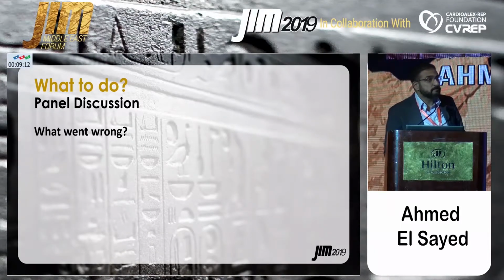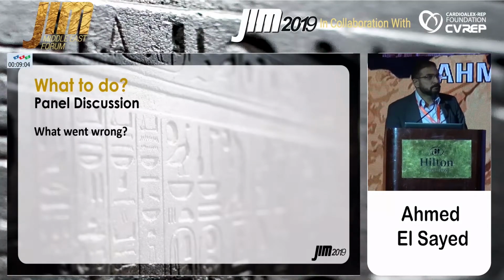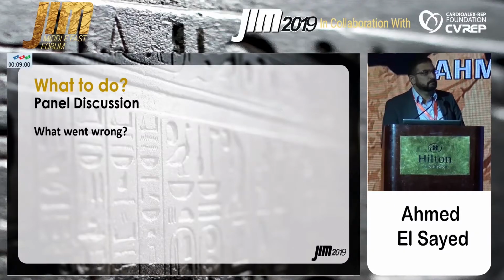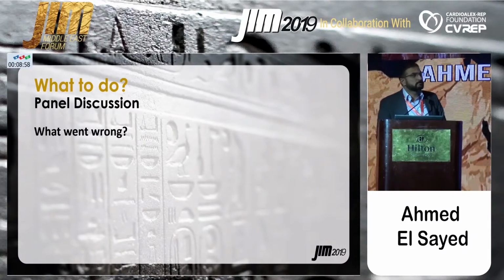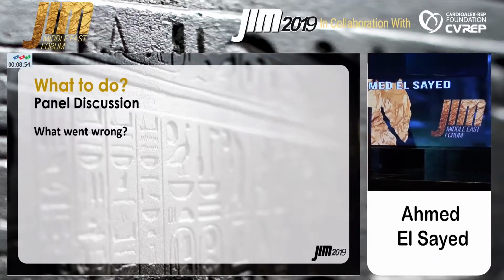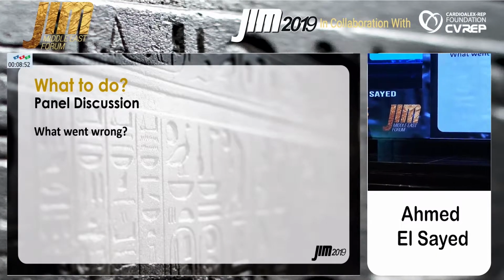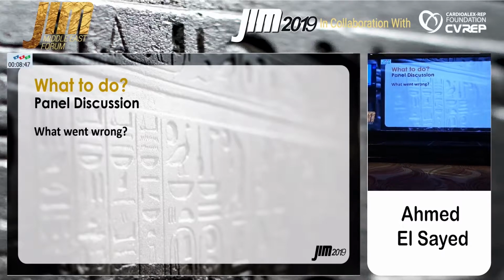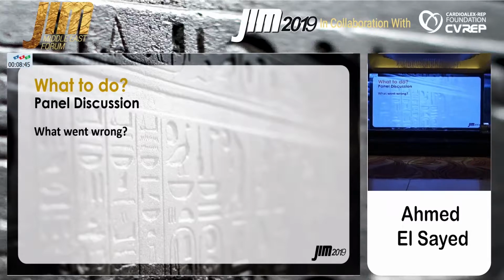Yeah, but this is not unusual. We see this happening sometimes. The aortic valve area can be 0.5, so if you place a balloon inside, it becomes 0.1 or even 0. So you basically occlude the valve. So it's not a surprise. I think it confirms that the patient has critical aortic stenosis. Yes, exactly.